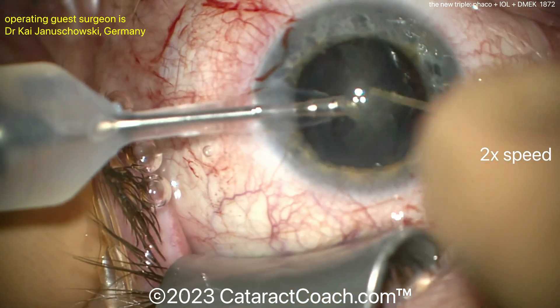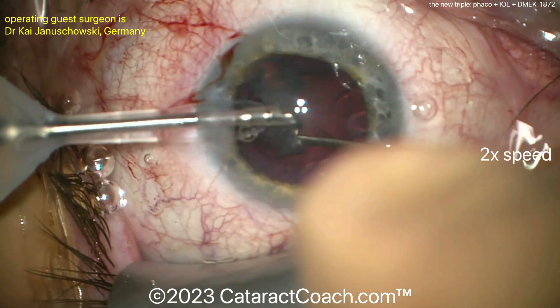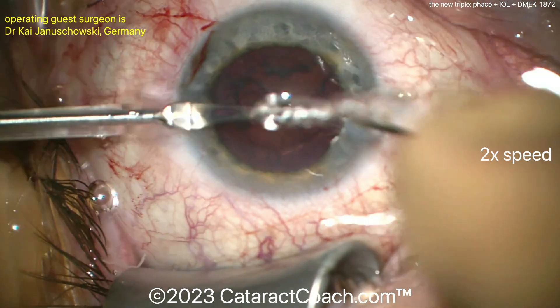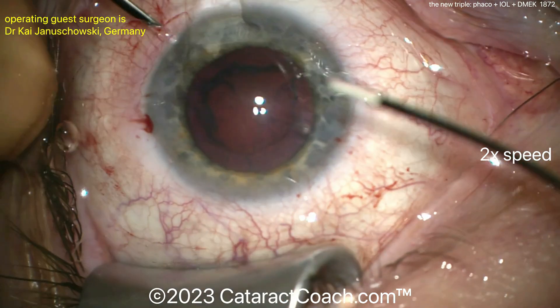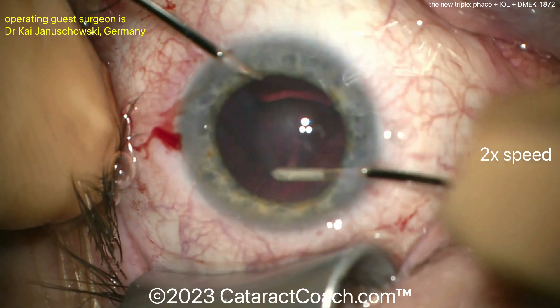Here the nucleus was prolapsed out of the bag — not too dense of a nucleus. It can be aspirated very efficiently. The surgeon is sitting superiorly; looks like a FACO probe in the left hand operating on a left eye. The nucleus came out very quickly at 2x normal speed. And now going to the bimanual approach to clean up the cortex.